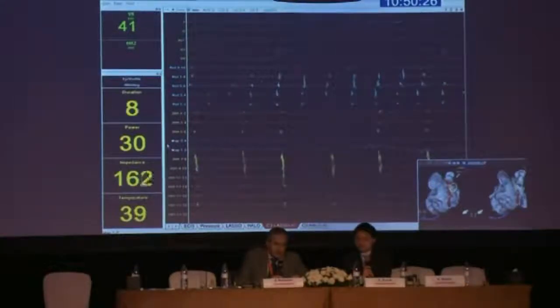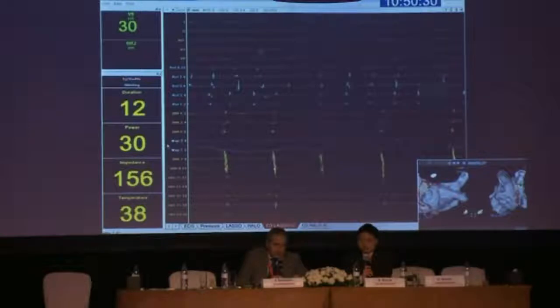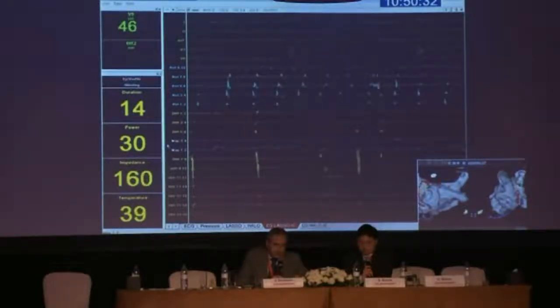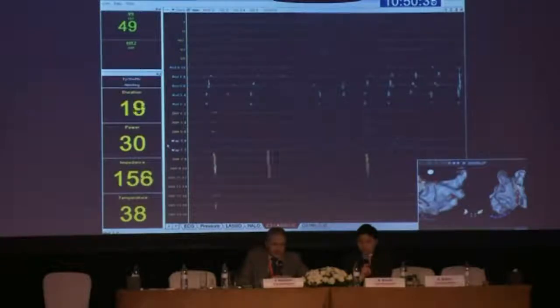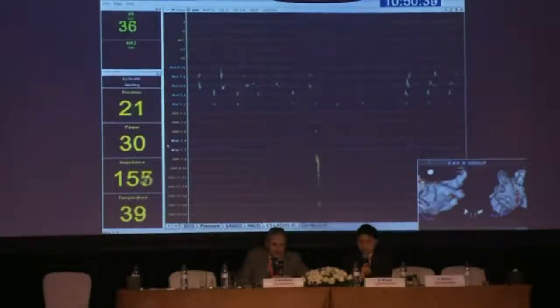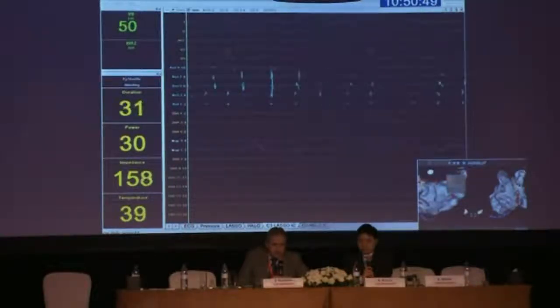That's exactly what happened here, Andre. So you can see that the FAM we created with the PV is bigger. And what I've done is I've added lesions that you can't see to draw in the isolation. Isolated. Yeah. I've added lesions to draw the FAM in to where the geometry truly is. Yeah. So you can't see the lesions because I'm using them just to pull in the FAM.